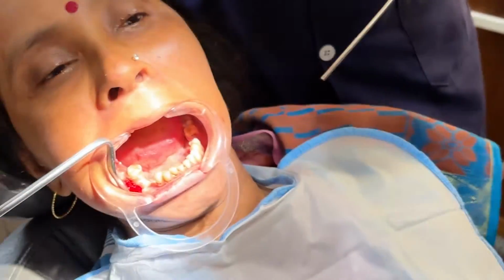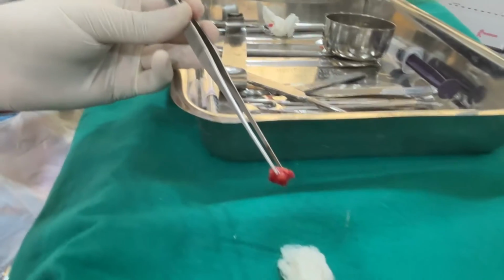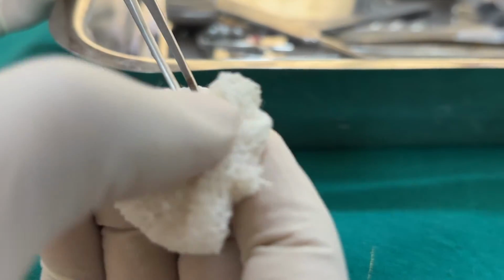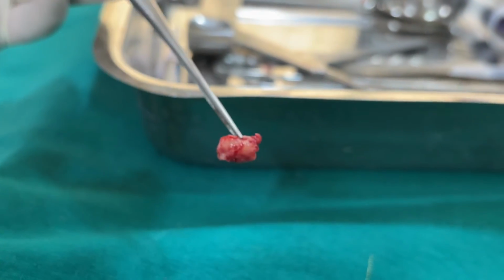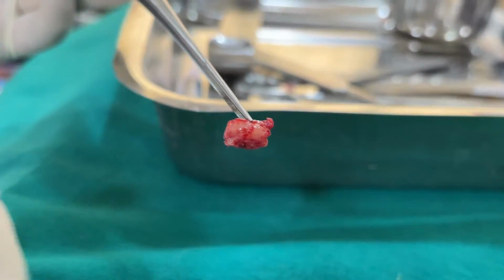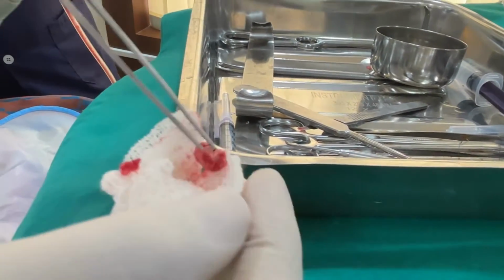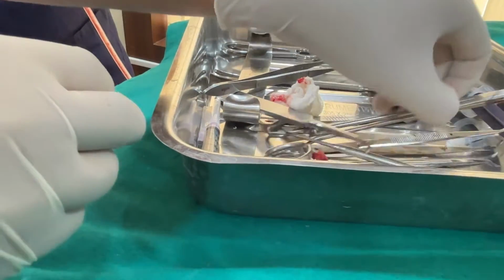Before we put it into the formalin and saline, we need to absorb the blood and keep it clean if possible, and then dip it into formal saline and send it for histopathological reporting. So that is how we take a biopsy. And now I will show you the closure of the area.